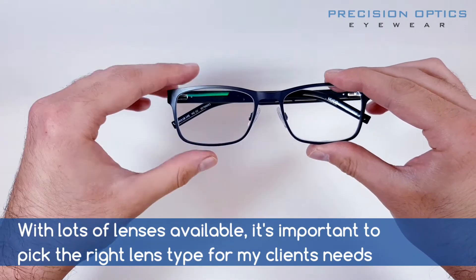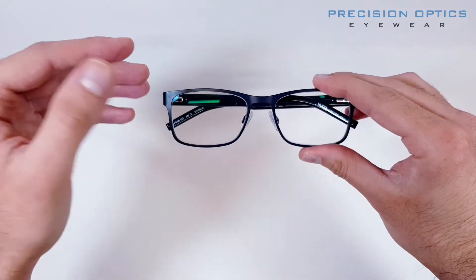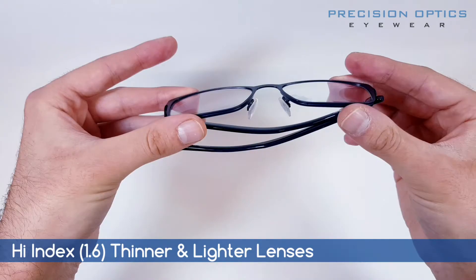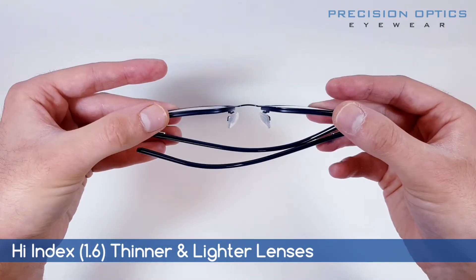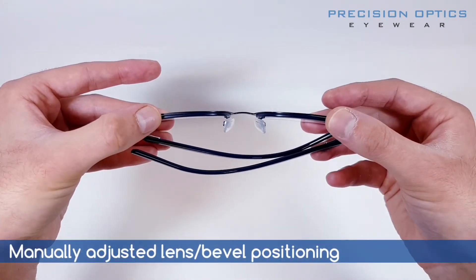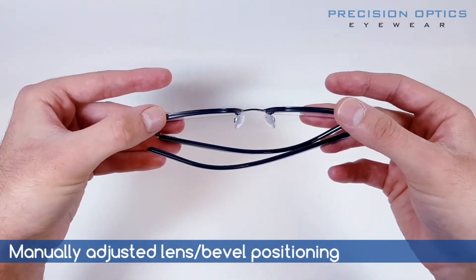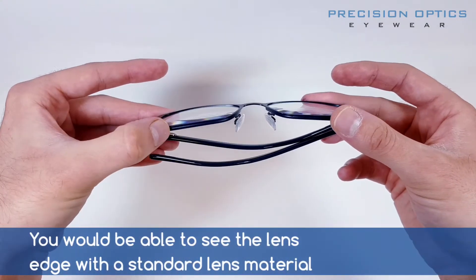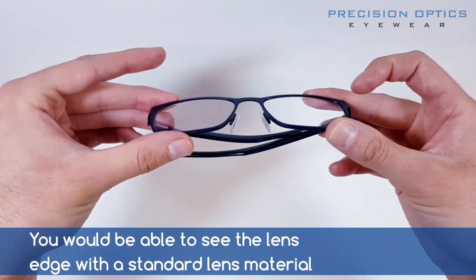With that in mind, we want to make sure a great frame has great lenses. So with this frame here, we've got some really nice high index thin and light lenses. I've made it so the lenses are completely in line with the frame. We could have gone with a standard lens, but I don't think we would have got this thinness.